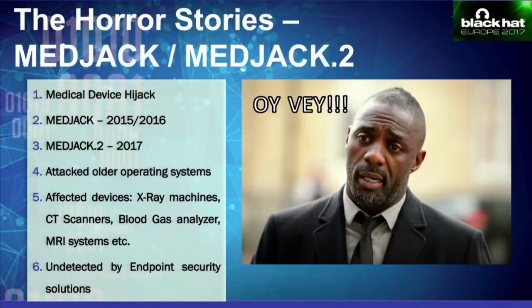While there are many horror stories associated with connected medical devices, from ransomware to malware, I specifically wanted to talk about MedJack because of all the attention it got and all the damage it caused. MedJack, or medical device hijack, is a malware that first came out in 2015 and lived through most of 2016.